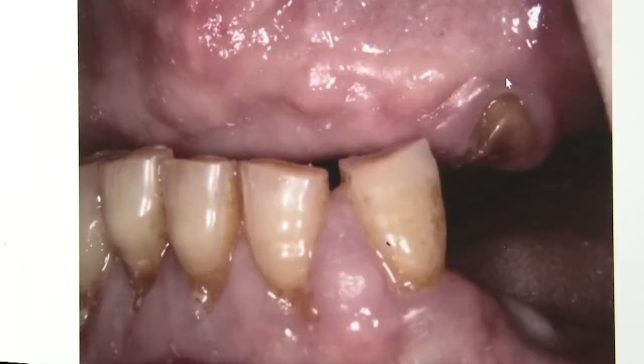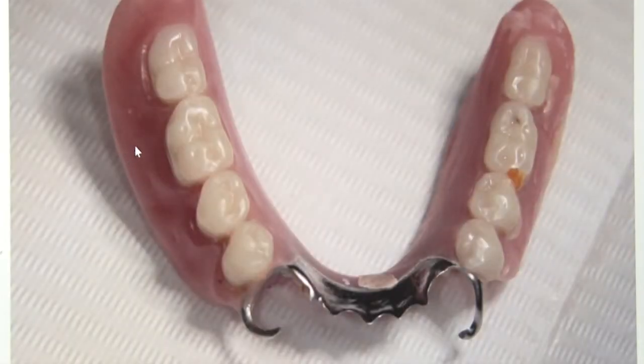Here is what her left side looks like, and you can see we did keep that one root, and it's causing no problems. So this is the lower removable partial denture that she's wearing.